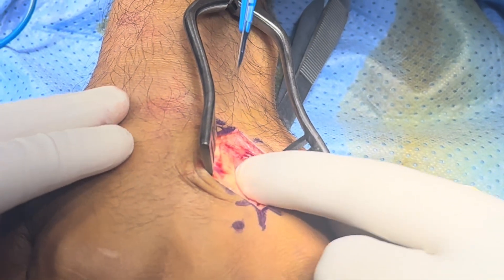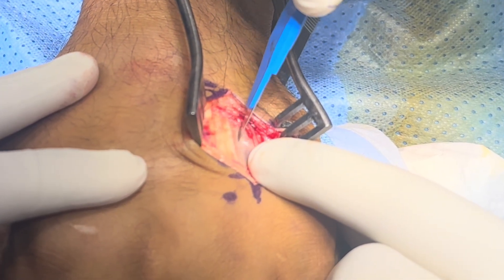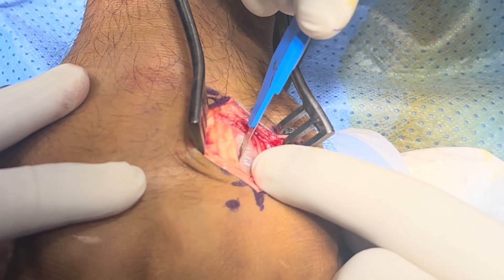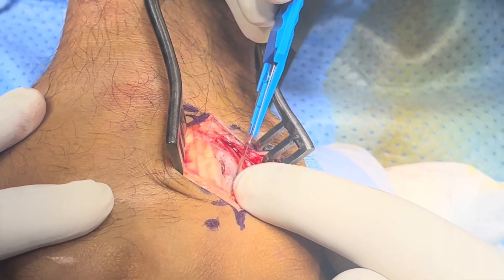Now I can feel the bone and release the fascia here. You can clearly see the interosseous here.